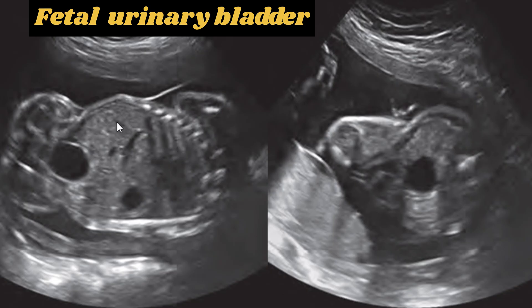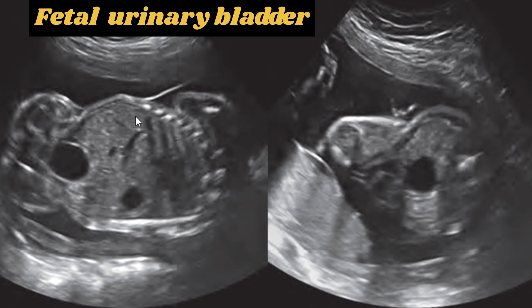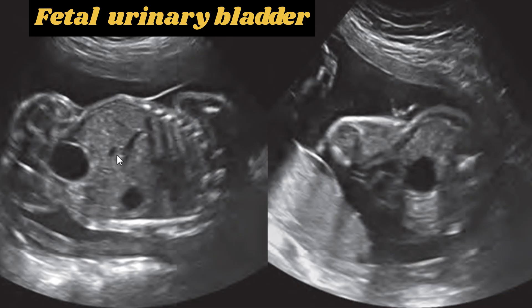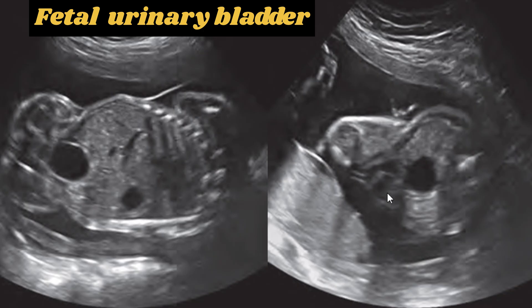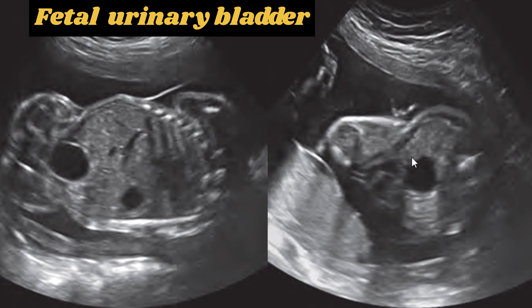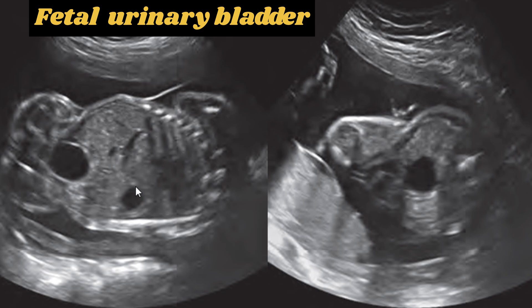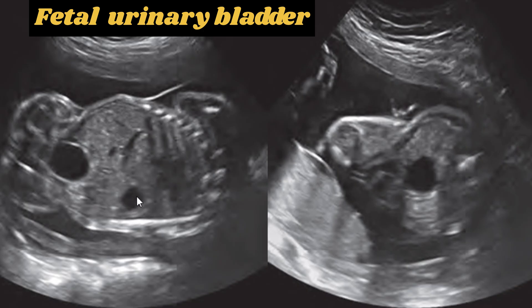Now we are going to discuss the urinary bladder in a fetus at about 24 weeks gestation. In the longitudinal and transverse views of the fetal abdomen, the urinary bladder is visualized in the transverse sonogram, and the stomach bubble is also seen in the longitudinal sonogram.